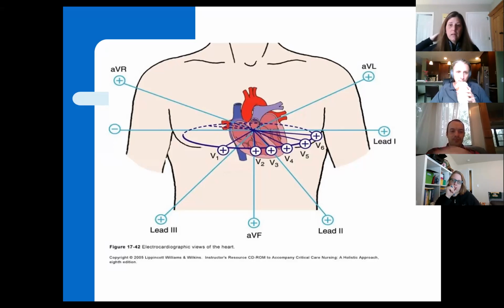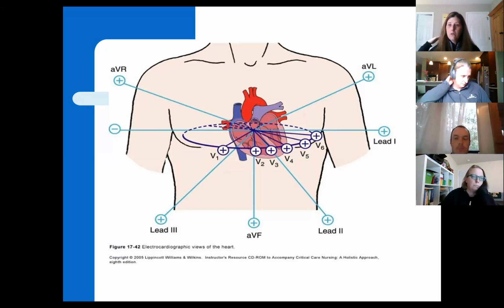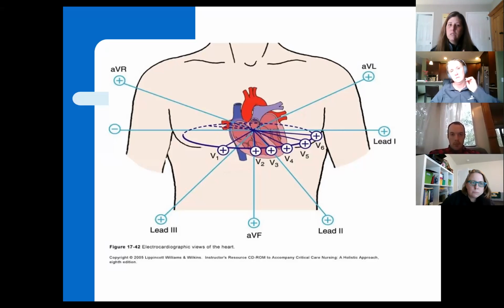The person behind me is not going to see what my face looks like. The person that's looking at my face is not going to see what behind me looks like. So this is looking at the heart that same way. It's getting a different perspective. And so then it's helping us to be able to diagnose or identify what's going on and with what part of the heart, where are we having an issue.